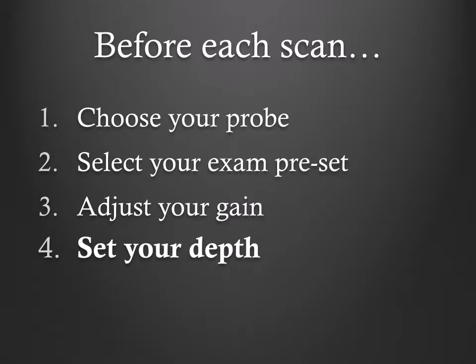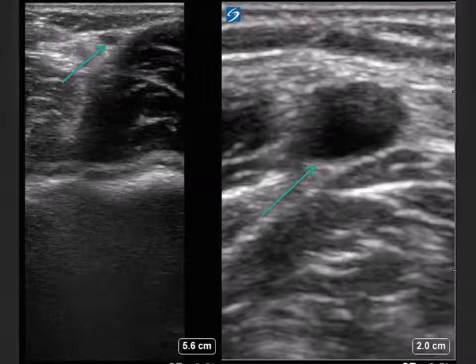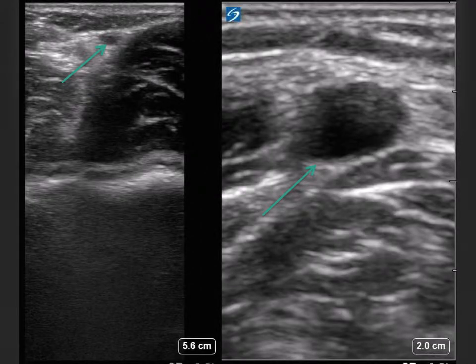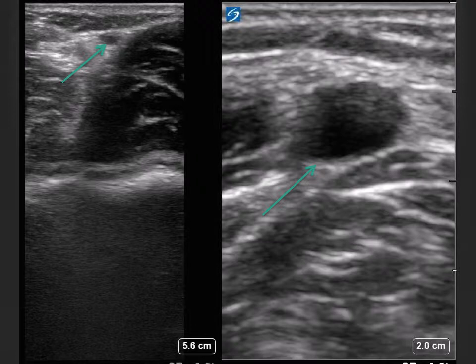Finally, set your depth. Set your depth to keep your area of interest in the middle third of the screen. If looking at lung parenchyma, set the depth for parenchyma to at least three times the depth of the pleura, which usually translates to 10 to 15 centimeters. Otherwise, set the depth so that the pleura is in the middle third of the screen.